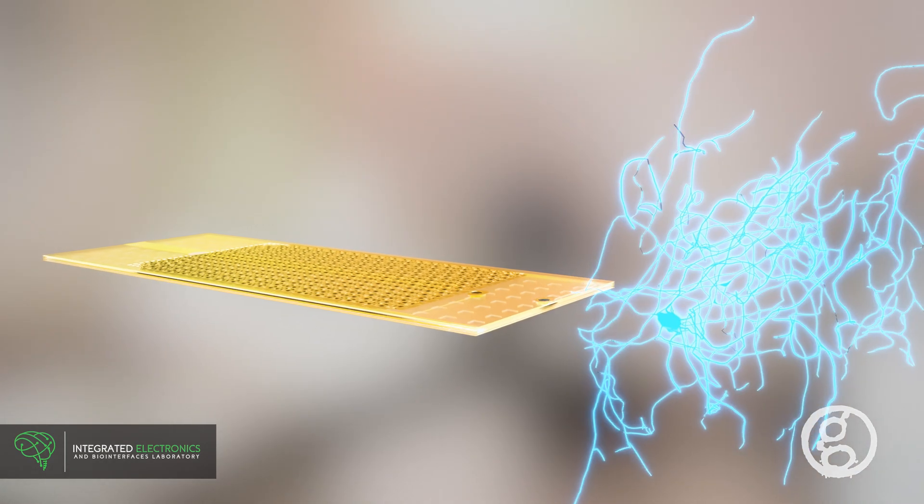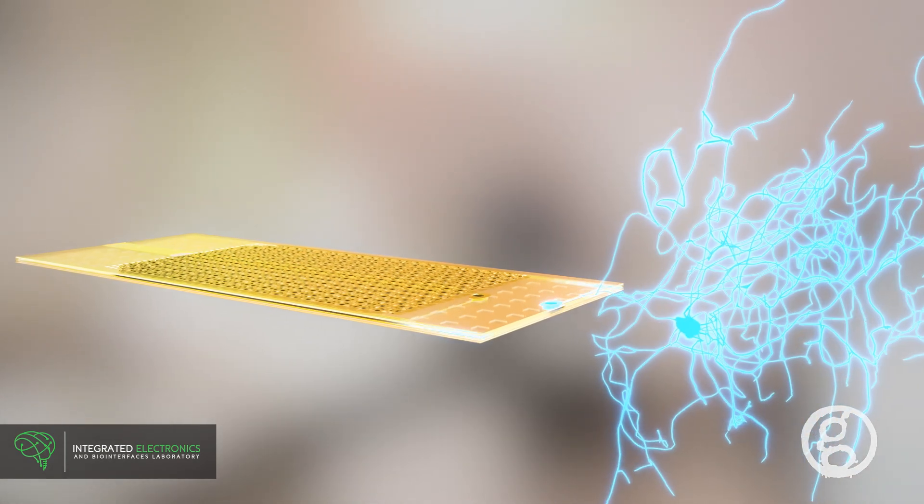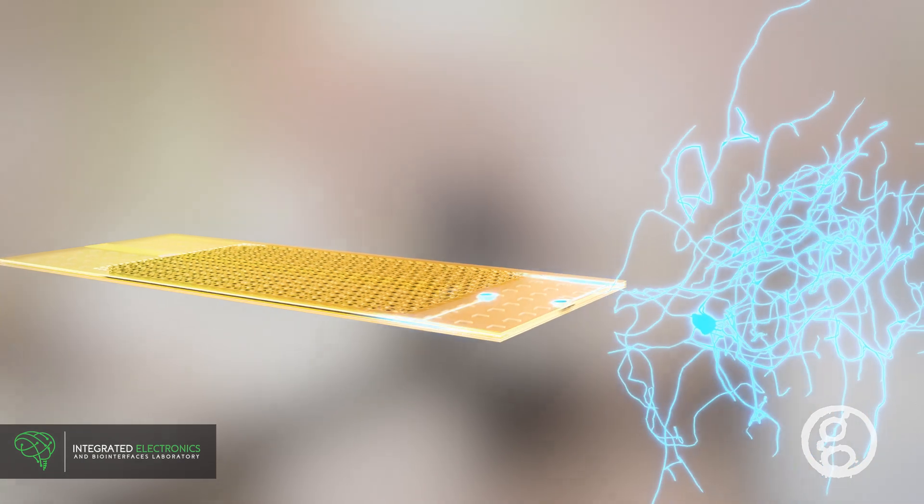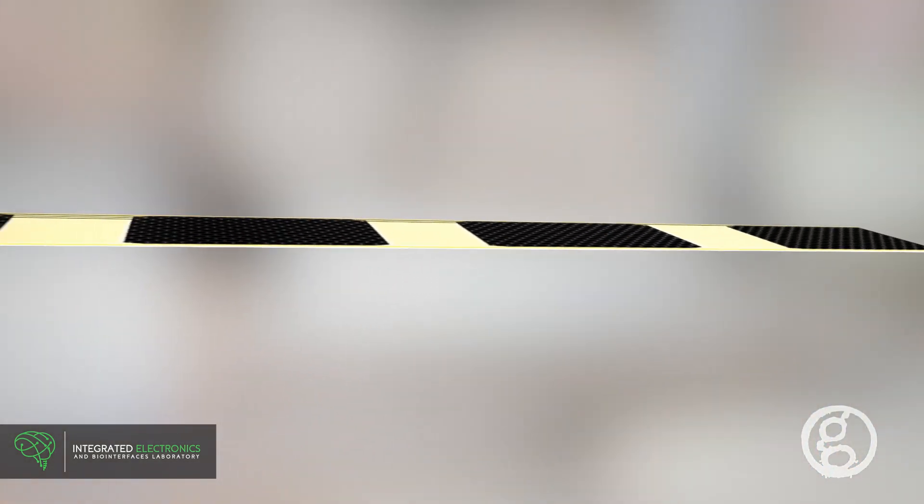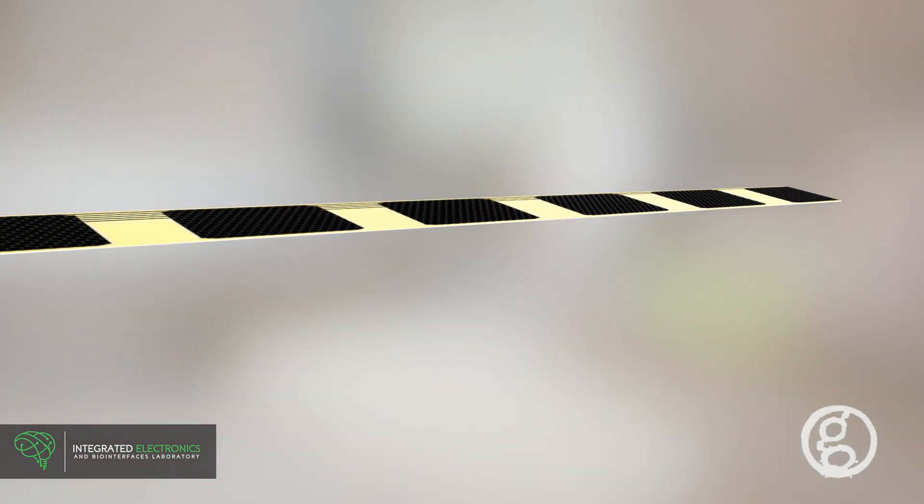The UCSD Micro-SEEG can record neuronal signals with microcontacts and stimulate neurons using macrocontacts with clinically acceptable levels. At over 10 cm long, the UCSD Micro-SEEG reaches deep brain structures.